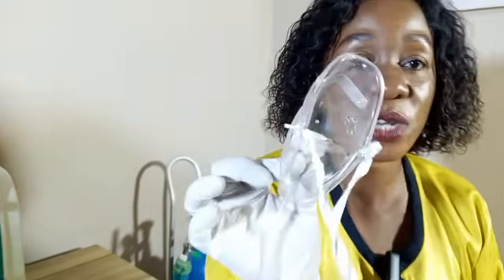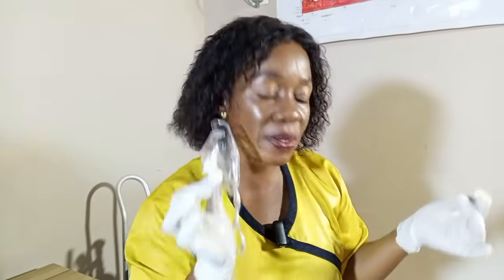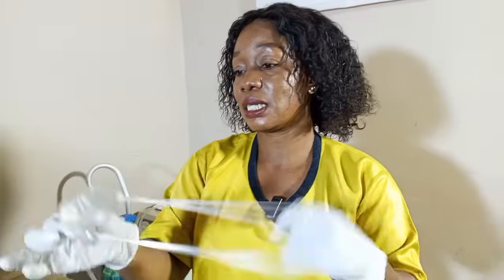Another way to know whether the oxygen is moving is to bring the tubing close to your ear — you will hear a wind sound. Please do not put it inside water to see bubbles. If you hear that windy sound, you know the oxygen is flowing. The humidifier is connected and the oxygen is ready to administer to my patient.